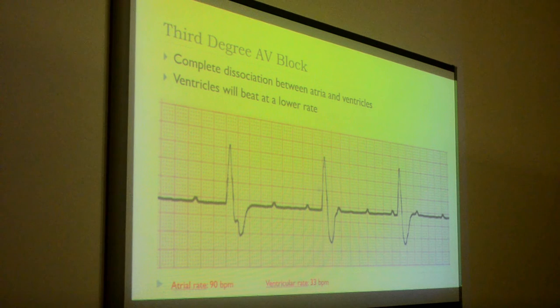And okay, you can say this one maybe, but then this P wave comes right here, this P wave here, this P wave here. There's a P wave in the QRS here and here. Once you start seeing P waves in the QRS complex also, you know this is complete dissociation, because normally they shouldn't be firing like this. So many skipped beats, so that will more likely be treated. And there's another hint that we'll discuss later on about this.